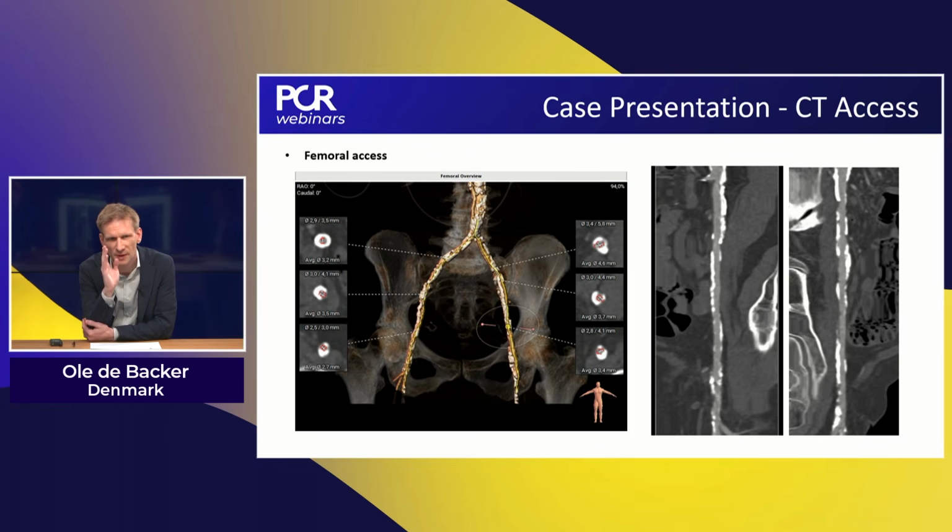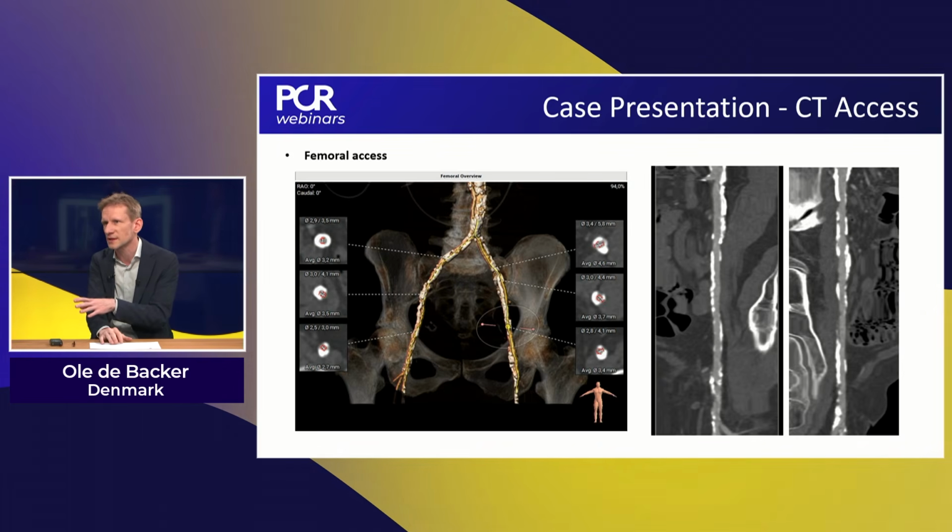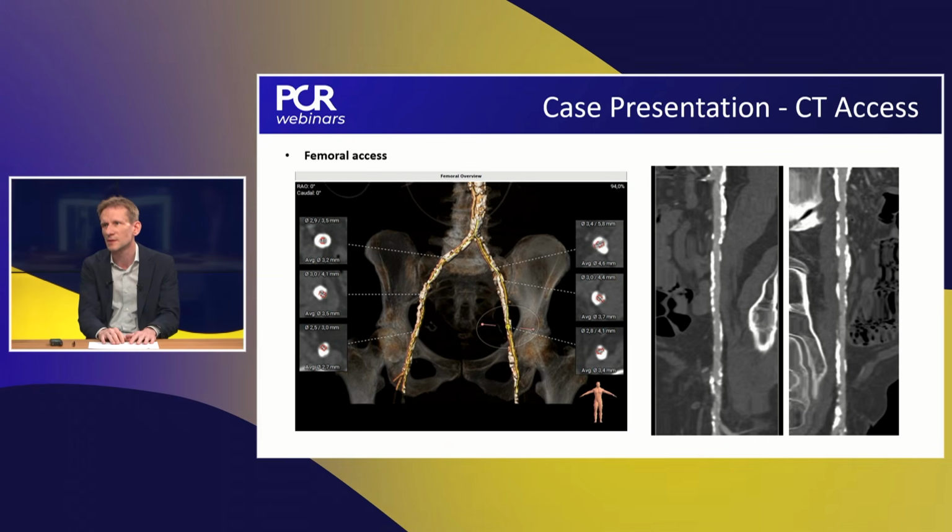This is a completely diffusely diseased vessel involving heavy calcium, intraluminal diameters which go below even 3 millimeters on both sides, and you see indeed the puncture site is involved with calcium, or even half a centimeter or a centimeter above the puncture site, you run into immediately calcium that's set to dissect and get you in trouble afterwards. So if there would be for sure an alternative access, this would be a no-go for me. Yeah.